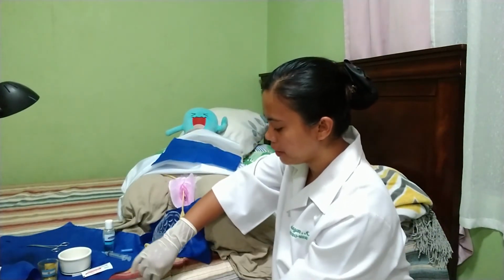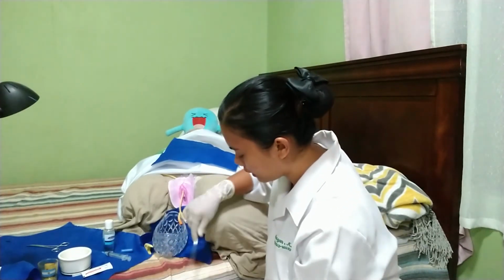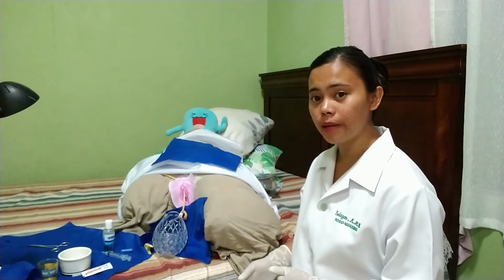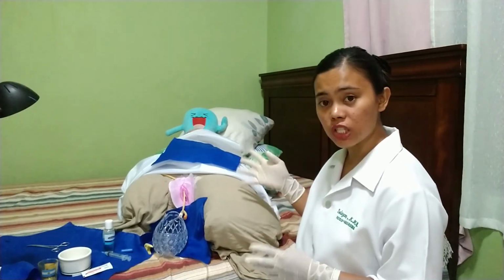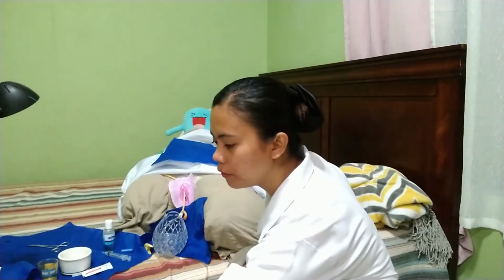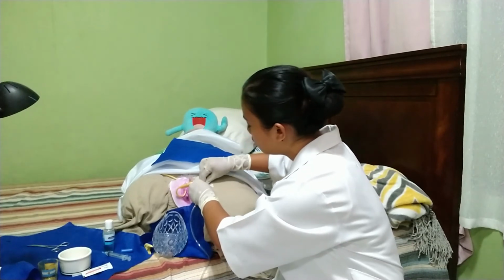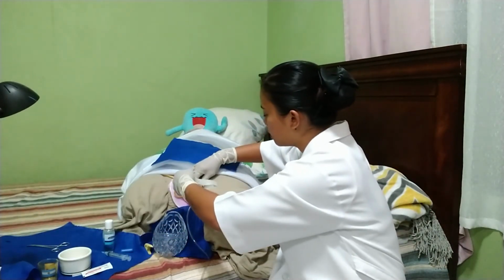Now we have to remember that the tube must be free from kink or anything like that to avoid blockage or fault in draining the urine. After hanging the urinary bag on the bed frame, we may now anchor our catheter tube on the patient's inner leg using 2 tapes. One shorter tape would be placed on top of the patient's inner leg, while the longer tape should be placed over it.